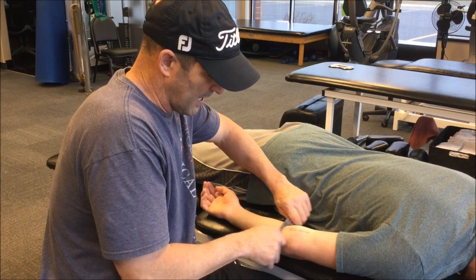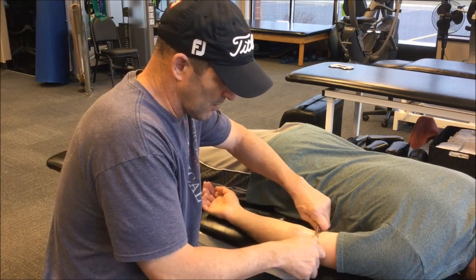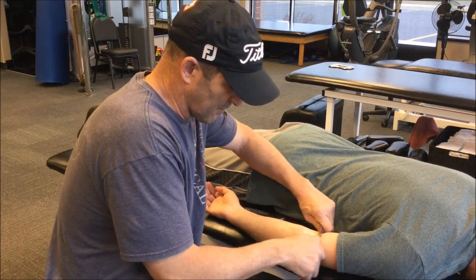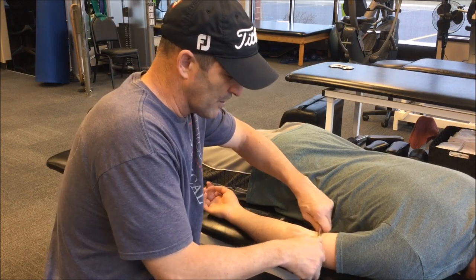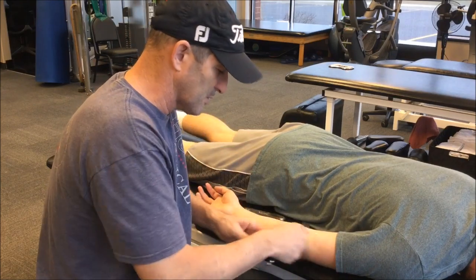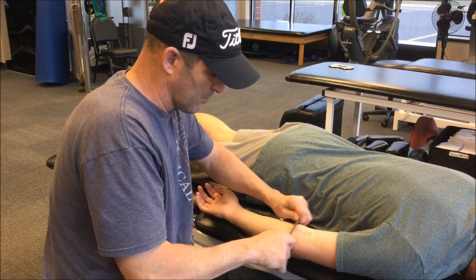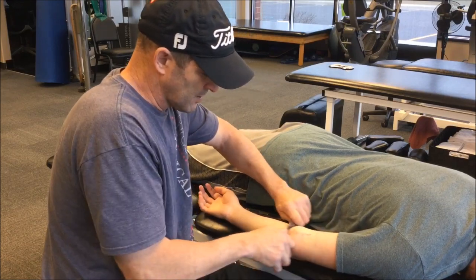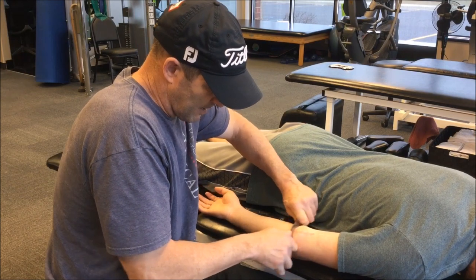You've got to do these things on yourself — have multiple people try them on you — so you know which areas you can push hard and which areas you absolutely don't want to push hard. Over the medial epicondyle is not a very comfortable position to be pushed on. With the first technique, I'm constantly going up and down, mobilizing superiorly. It's so important to test where your hypomobility is, because sometimes you want to change your orientation. If there's more inferior hypomobility, I'll change the angle and push downward. For Max, it was more of a superior hypomobility.